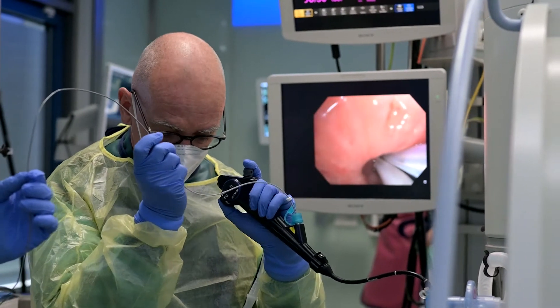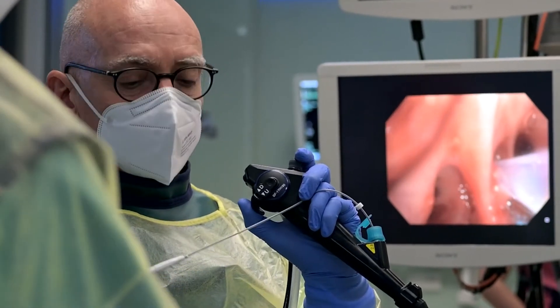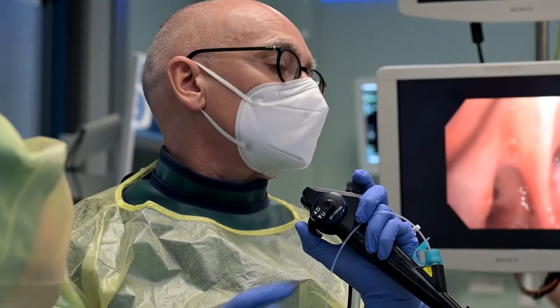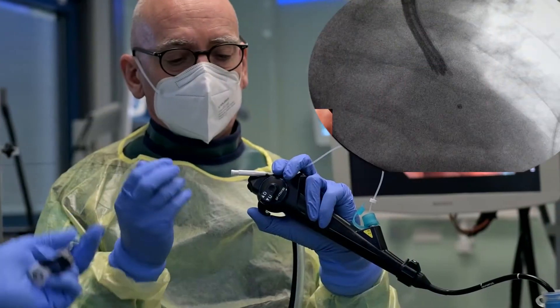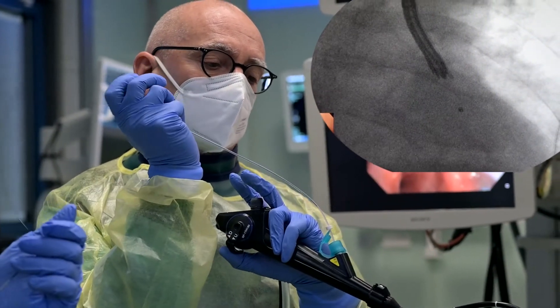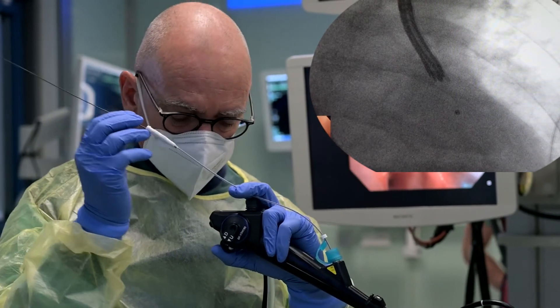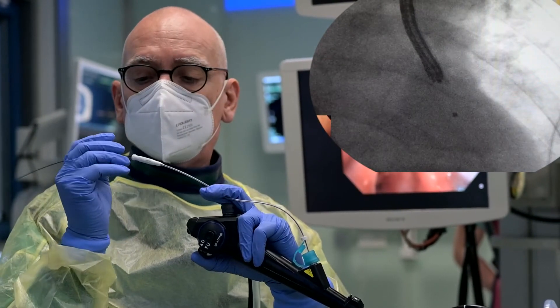This allows the bronchoscopist to use two fingers to hold the bronchoscope, preventing dislodgement of the sheath. This method can be particularly helpful in lesions that are barely visible under fluoroscopy, such as ground glass opacity lesions, small nodules, or those located in the beam path along with other dense structures. The flexible single-use 1.1 mm cryoprobe is inserted into the guide sheath. Fluoroscopy is used to bring it into the exact same confirmed position of the radial eBUS probe in the lesion, advanced just as far in relation to the fluoroscopy marker of the guide sheath as the radial eBUS probe was before.